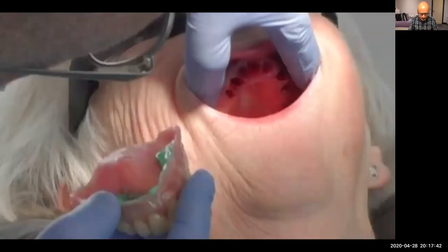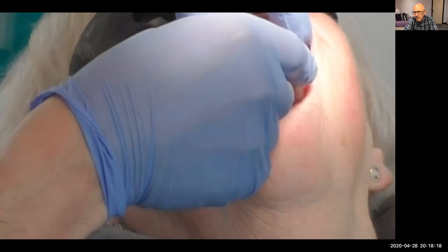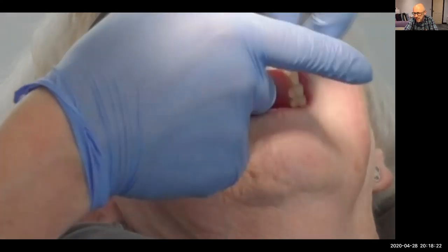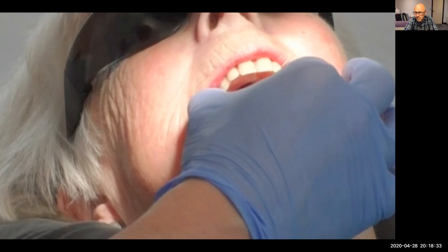So what I do is, with the patient there, this happens to be Anne. It's a different patient to Donna, but we've just taken those upper front teeth out. What I do is I put inside the fitting surface of the denture here some light-bodied silicone impression material. This is Doric Flow. It's any PVS material that you'd use for your crown and bridge work. I just flow it in, and then I seat it in the mouth like this. So we take it to Anne, gently rotating. Now remember, Anne's totally numb. The local anaesthetic's in there, so she can't feel anything. So she wouldn't be able to tell me whether it was rubbing or not, and it would be a good few hours before she could tell me. So this just gives me an idea.